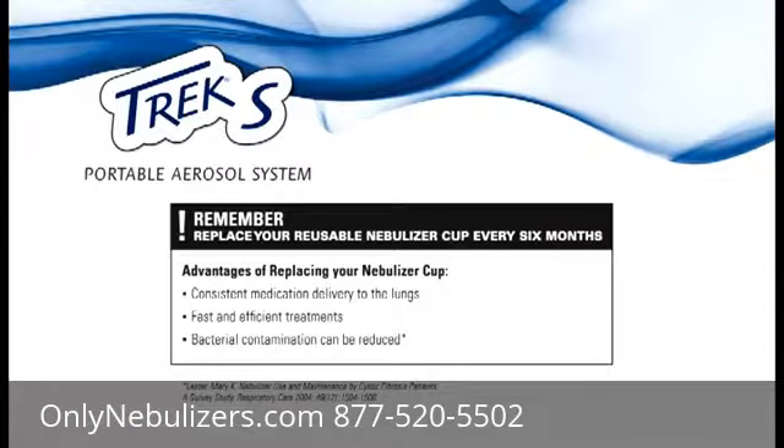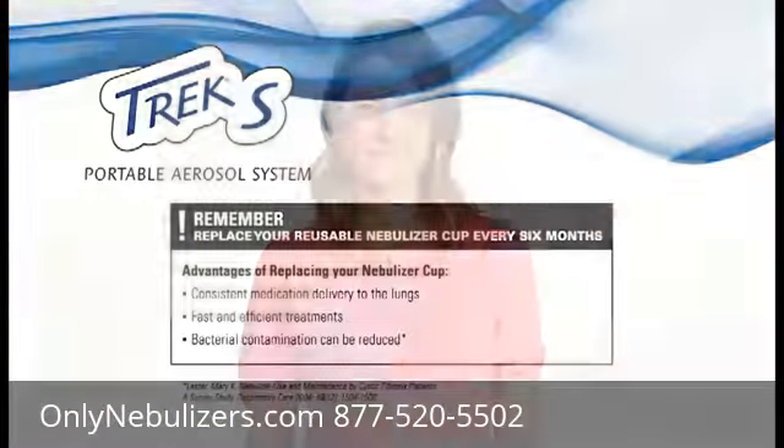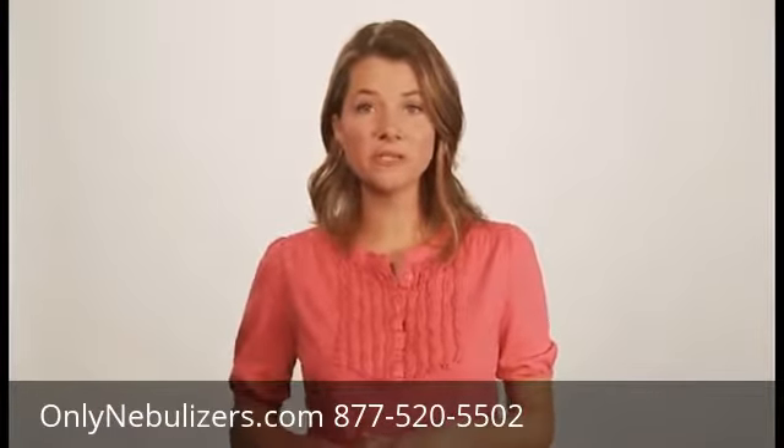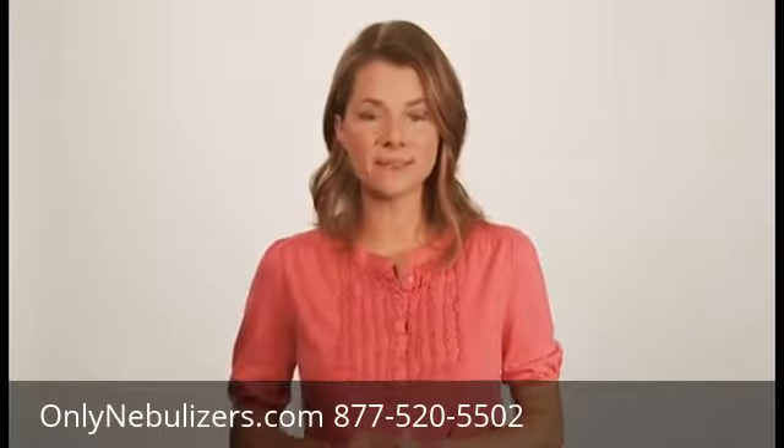Your Pari nebulizer cup is reusable but should be replaced after six months from first use. Replacing your nebulizer cup will help ensure consistent medication delivery to the lungs, maintain fast and efficient treatments, and help reduce bacterial contamination. It's very important to replace your reusable nebulizer cup every six months.